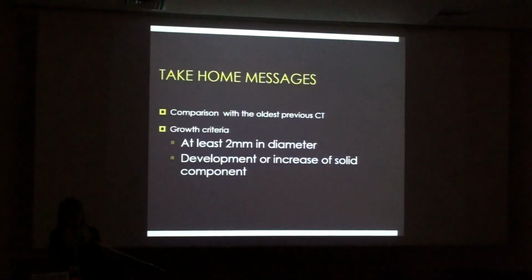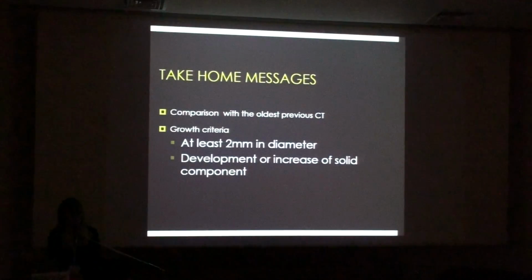And finally, some take-home messages. Remember to compare the CT with the oldest previous CT that you can get, and regarding the growth criteria, consider at least 2 millimeter change as significant, or the development or increase of a solid component.